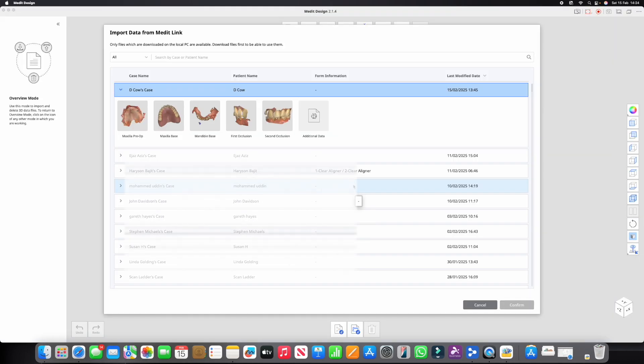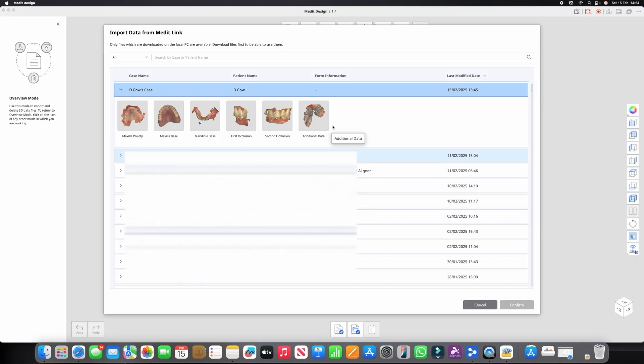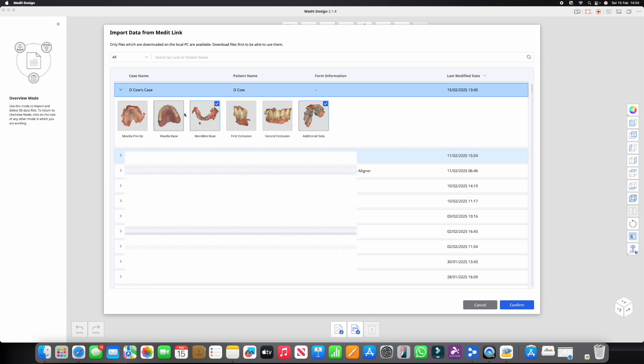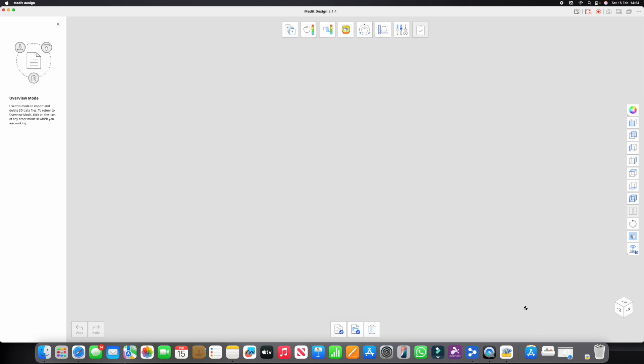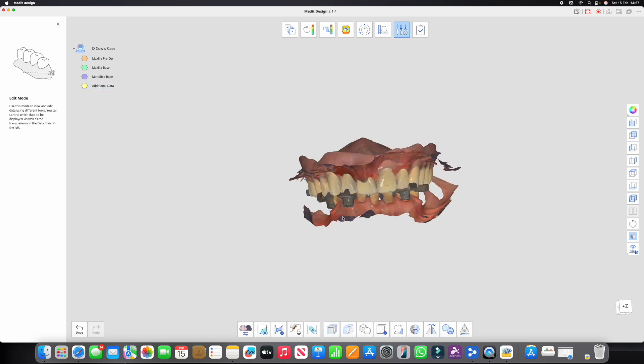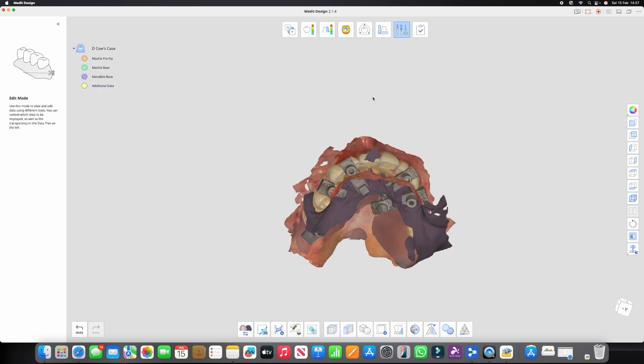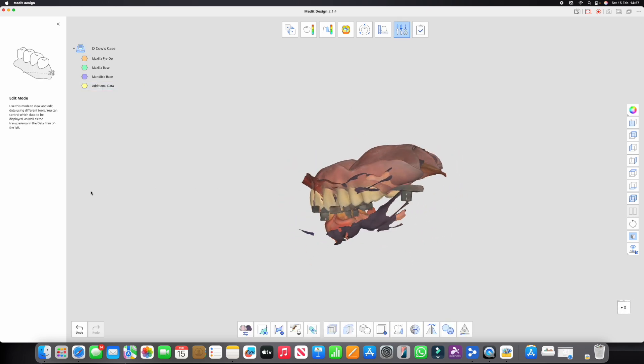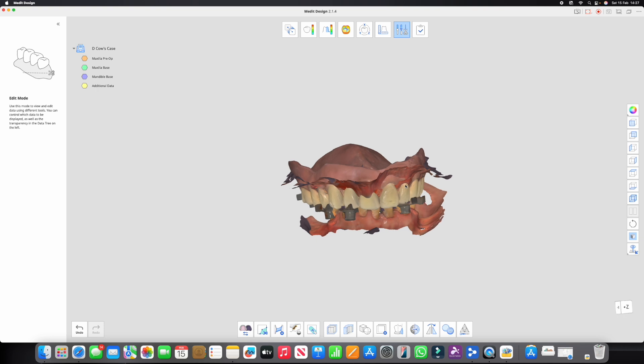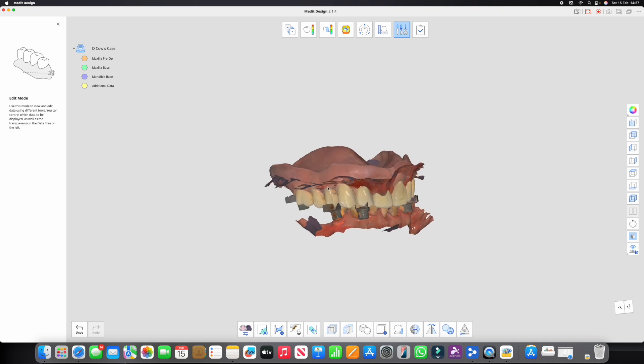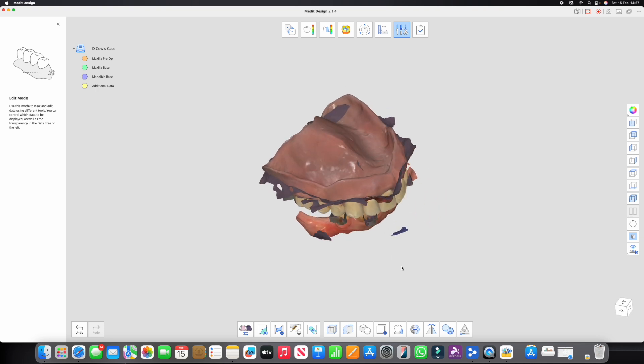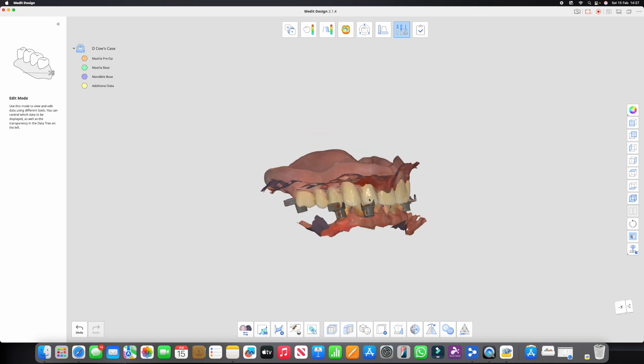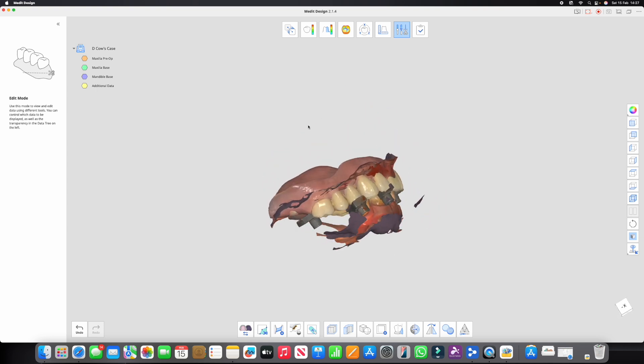We're going to load up Medit Design. We're going to bring in the additional data, we're going to bring in the mandibular data denture and the gingival scan. Okay, so let's bring those in. Okay, so we've got all of the data here, and you can see we went over this before when it was in MeditLink Direct.